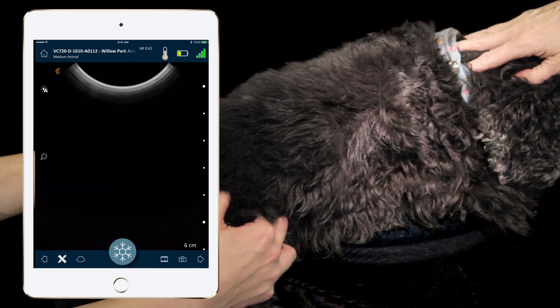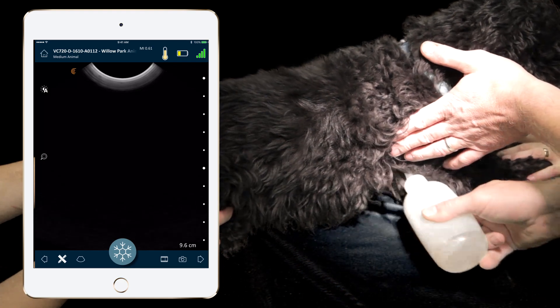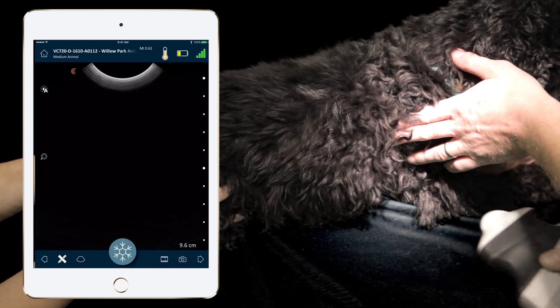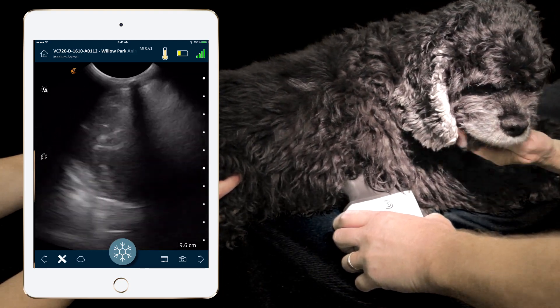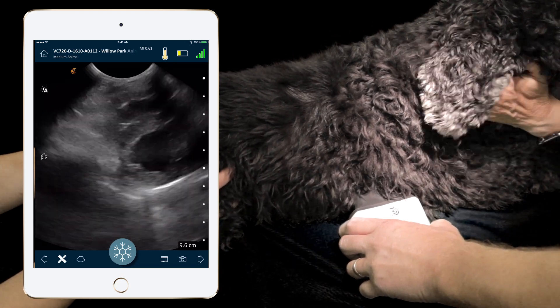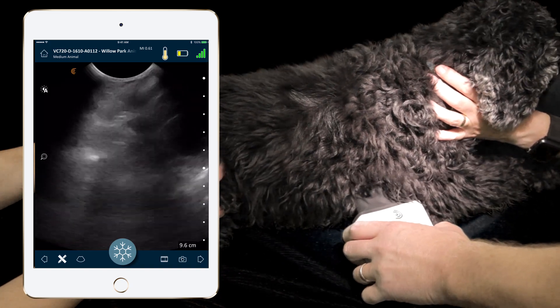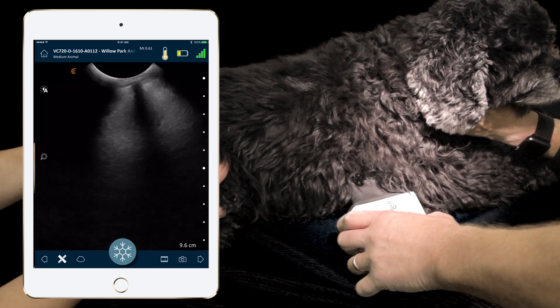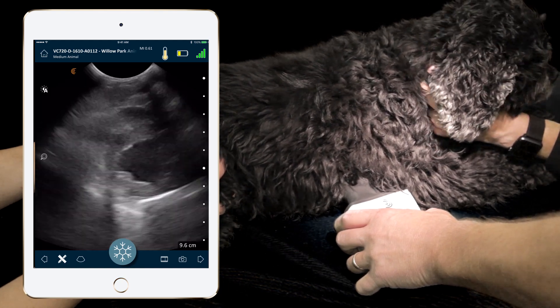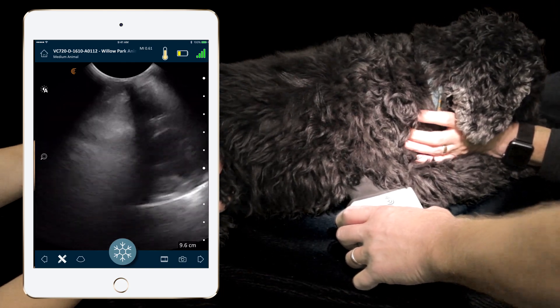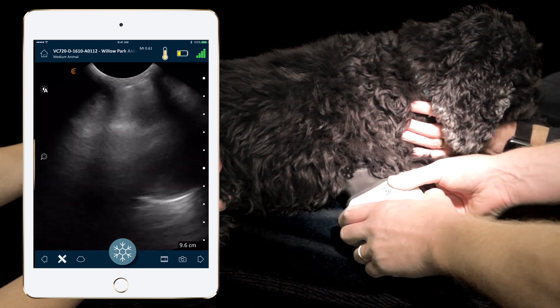That's the right-sided chest tube site in sternal recumbency. The fifth view of the FAST thoracic scan is the right parasternal view, where we assess for pleural fluid, pericardial fluid, and cardiac function. We locate the site by feeling for the strongest heartbeat, auscultating, or using the elbow landmark for the 4th to 6th intercostal space. Starting with the probe in short axis, we pick up the classic mushroom view showing the left and right ventricles. We can see the distal pericardial sac in white and identify the right ventricular free wall, ventricular septum, and left ventricular free wall — ruling out pericardial effusion.